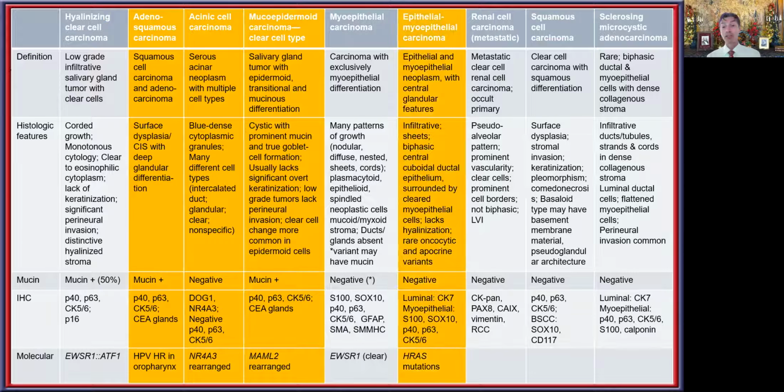So again, when you look at these two tumors immediately adjacent to one another and think about a clear cell mucoepidermoid carcinoma and hyalinizing clear cell carcinoma, it is often almost impossible in some cases to make a legitimate separation between these tumors. And so in some instances, after you've performed the immunophenotype and seen that there is complete overlap, because hyalinizing clear cell carcinoma can have mucinous cells present within it, it is in those settings that I will do sequential molecular testing.